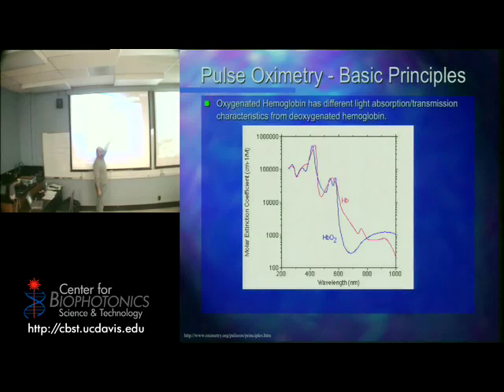So the darker red means you've actually absorbed more of the red. The lighter red means you've absorbed less and reflected more of the red. So this makes sense with what we see visually. Brighter red, the hemoglobin with oxygen.